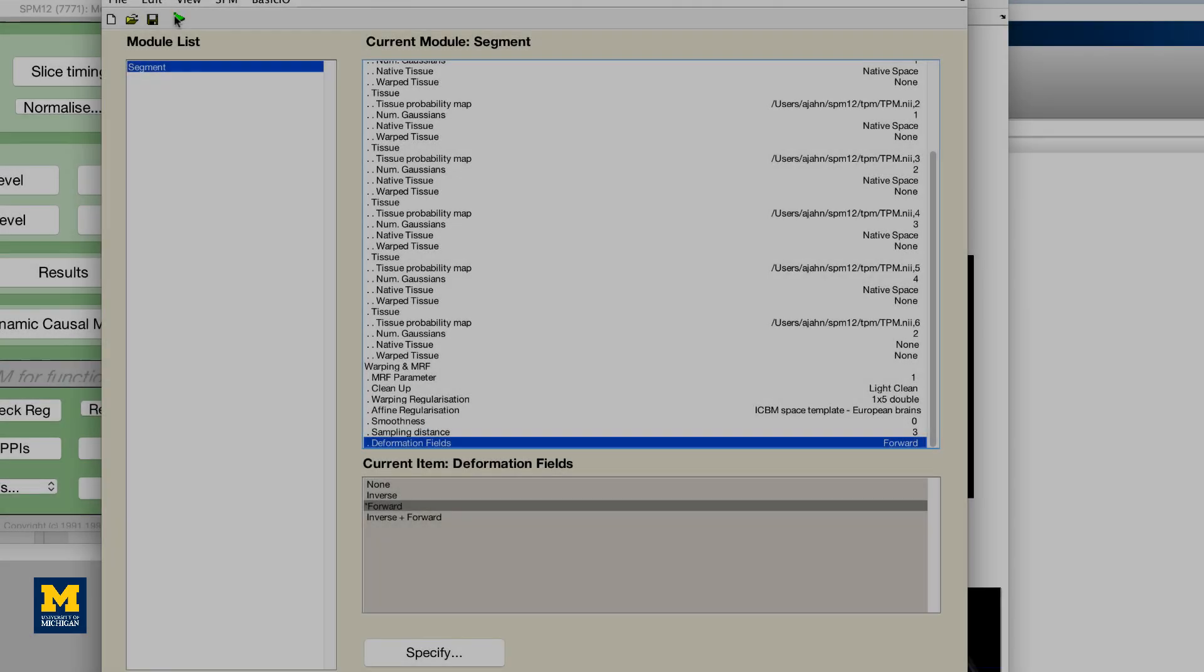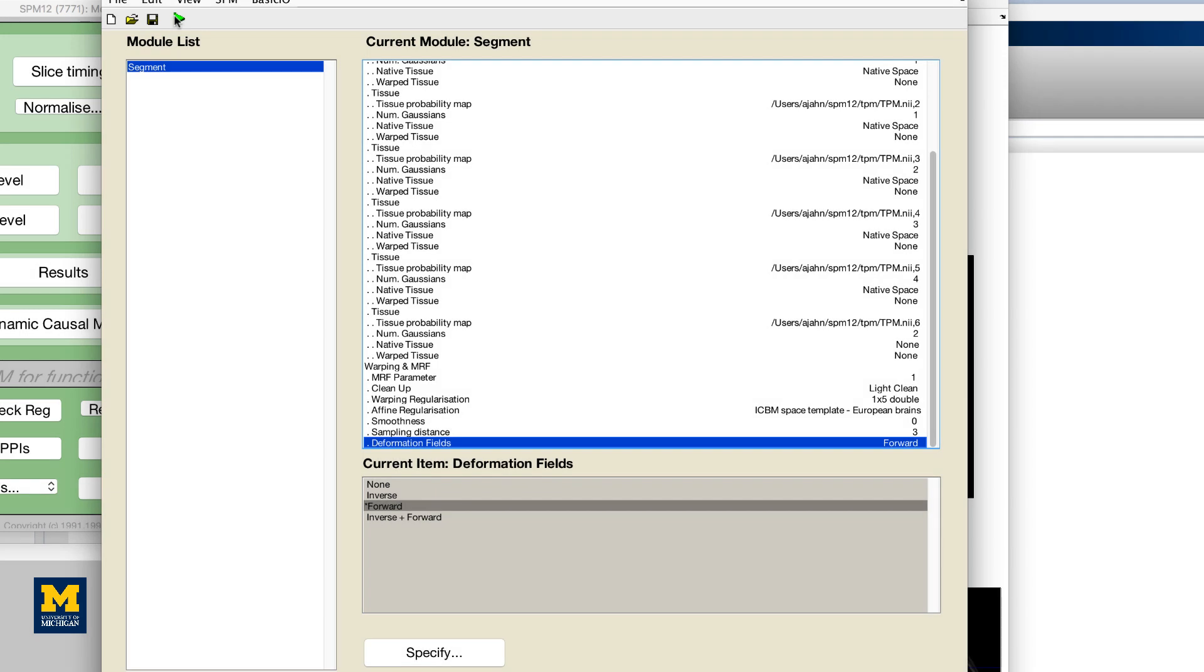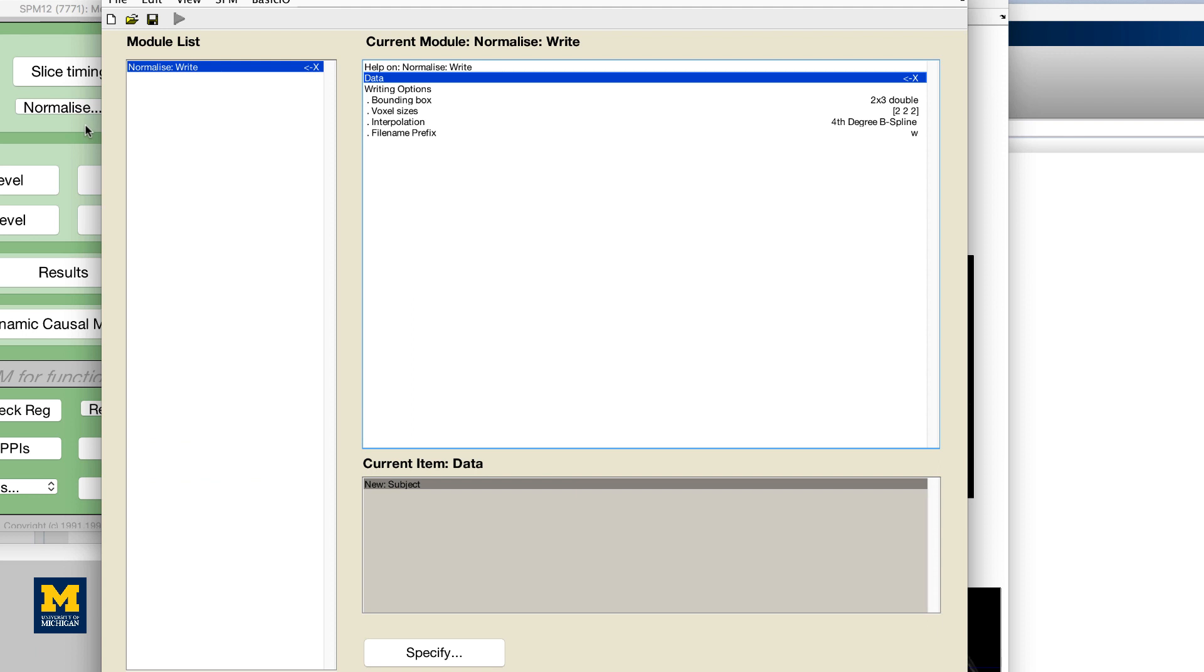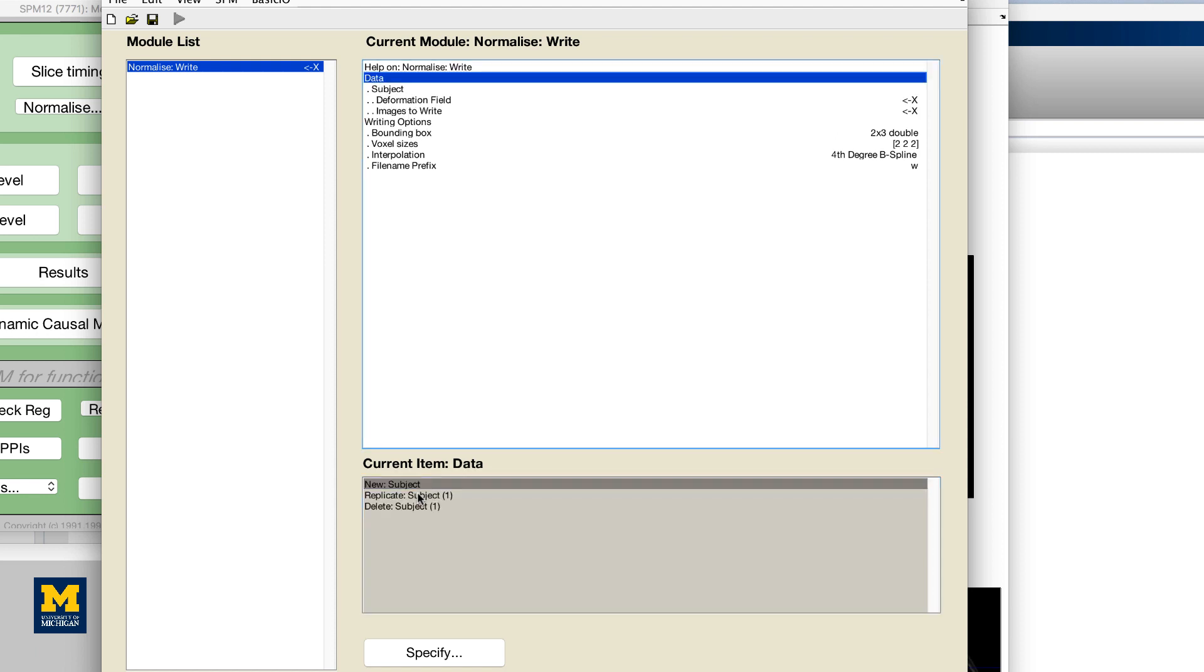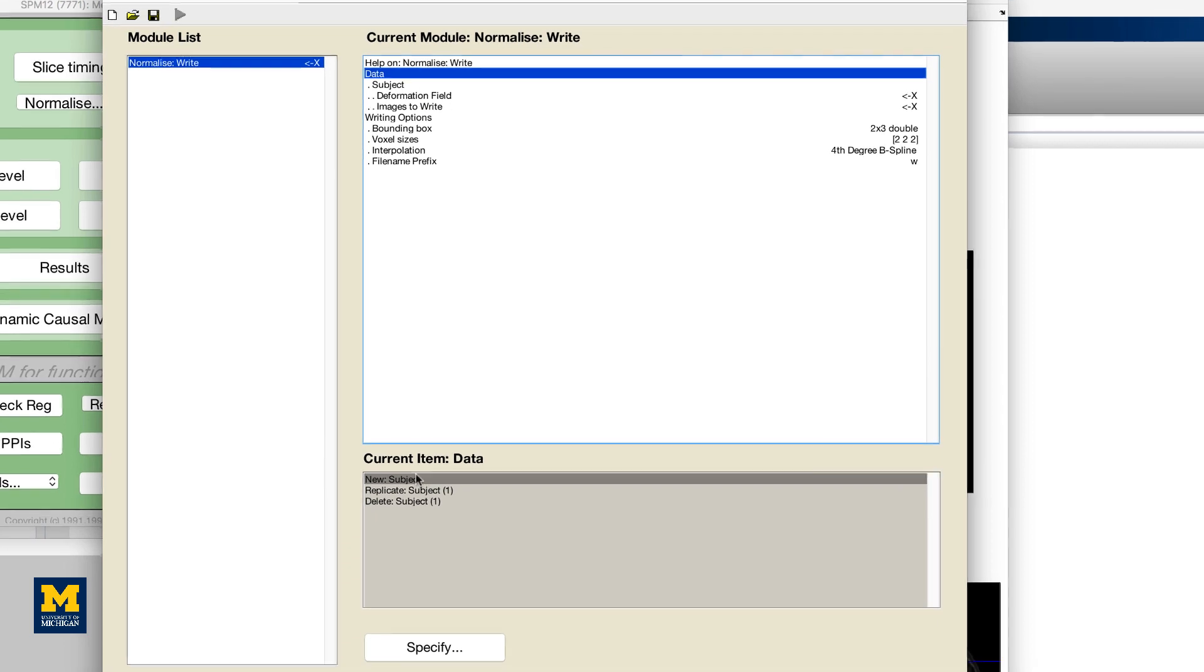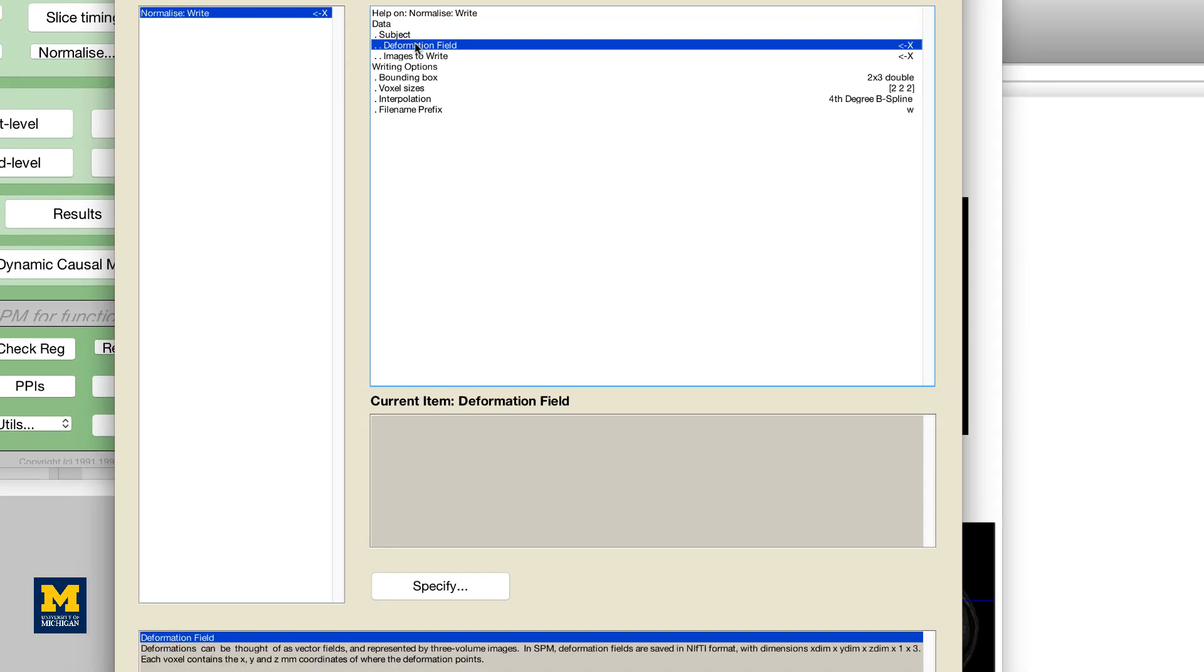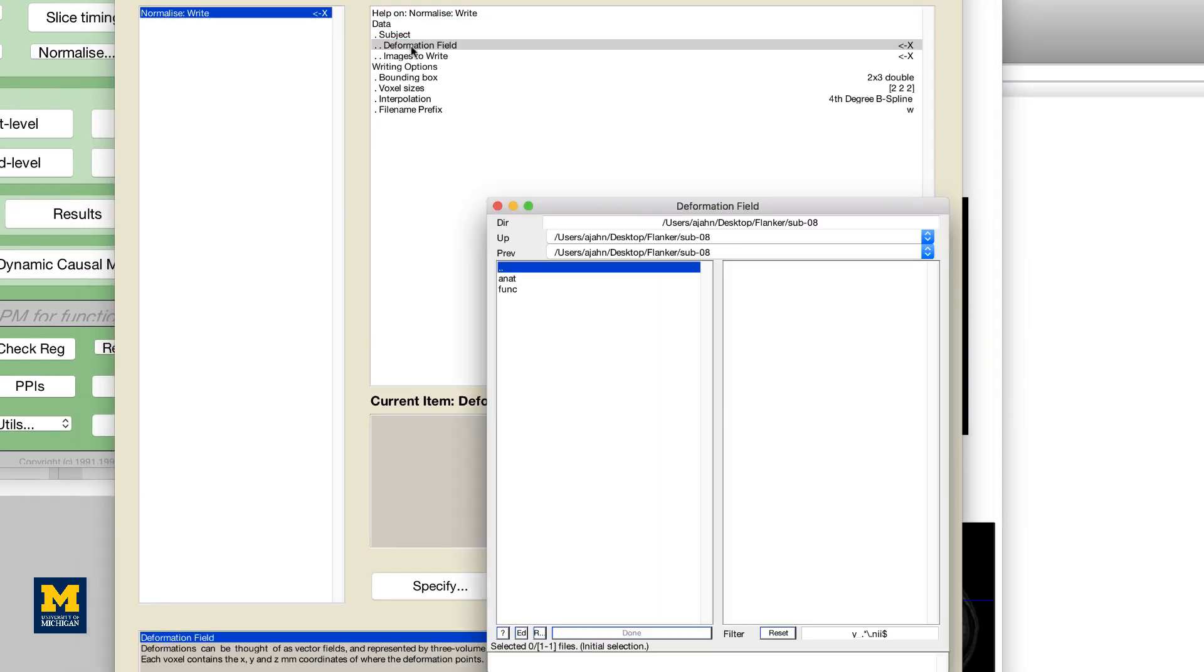Once the segmentation has finished, you are now ready to use the information generated by this step for normalization. Select normalize write, click on the data field in the batch editor, and create a new subject. Select the deformation field that you created in the anat directory, which should be called Y underscore R sub 08 T1W dot NII.